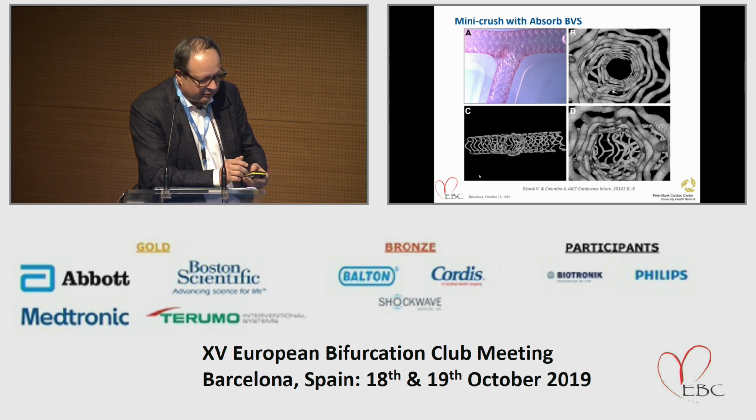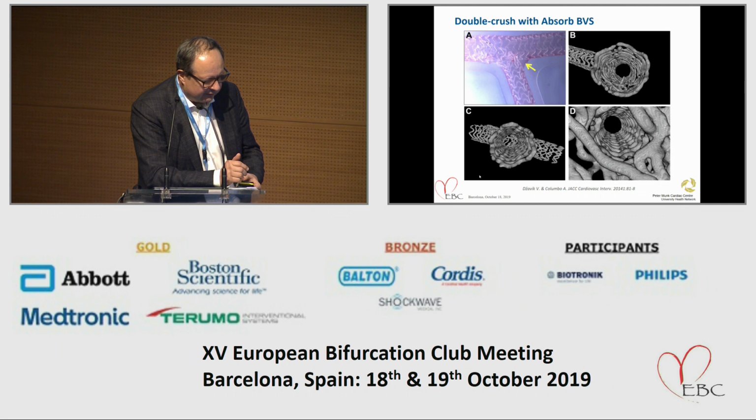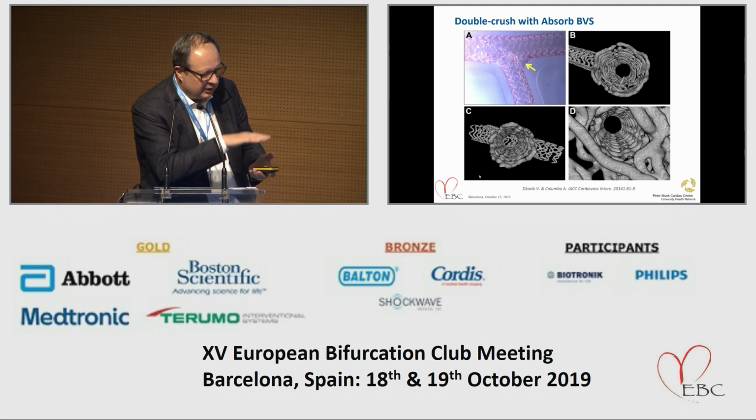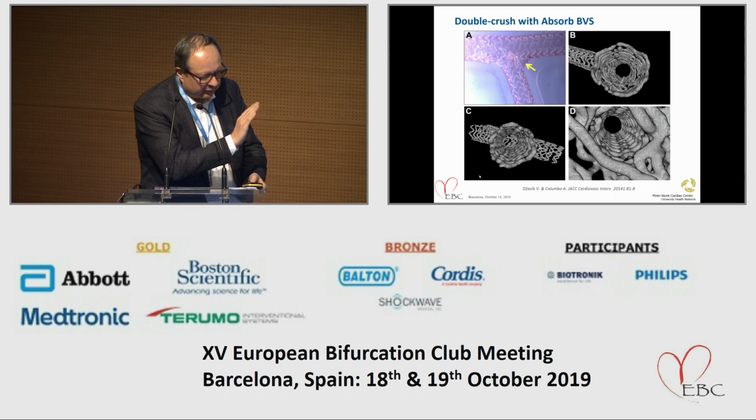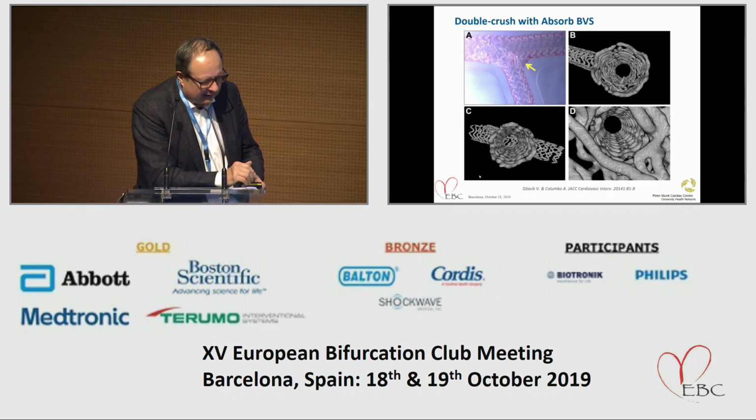This was a mini crush that we did at the Abbott lab in Santa Clara, and I think Antonio was also there just prior to that. This is a double crush, so instead of doing the first kiss, you actually crush, so that you don't end up with stent material in the wall or in the lumen of the main vessel. And you can see perfect circularity.